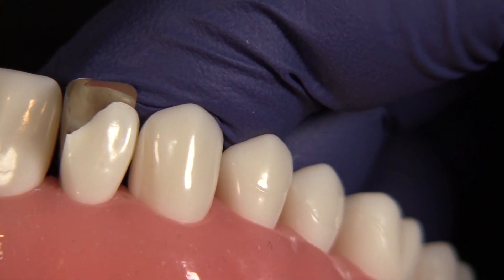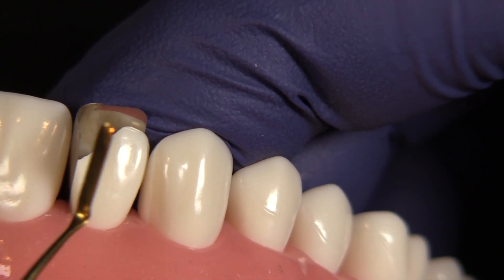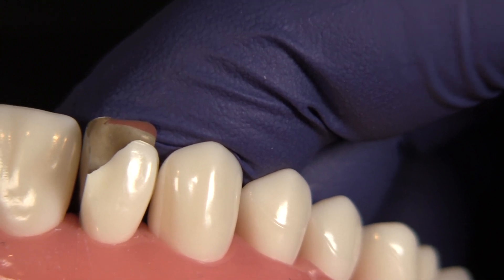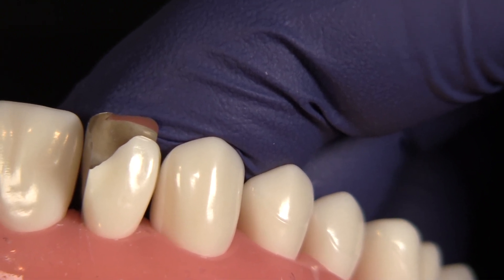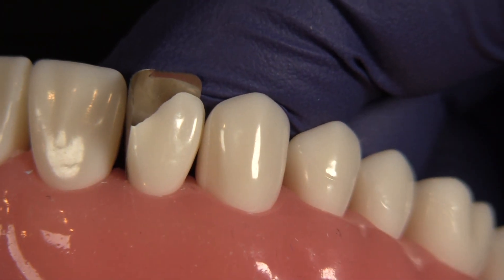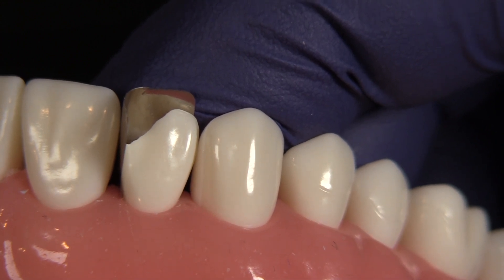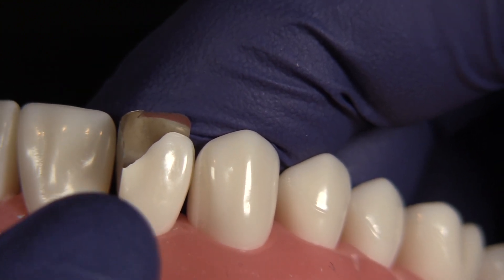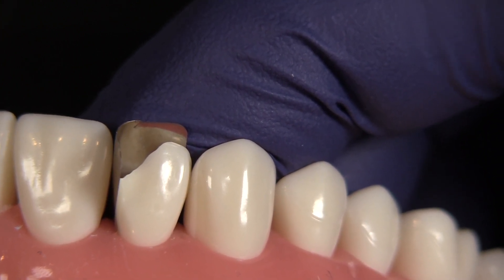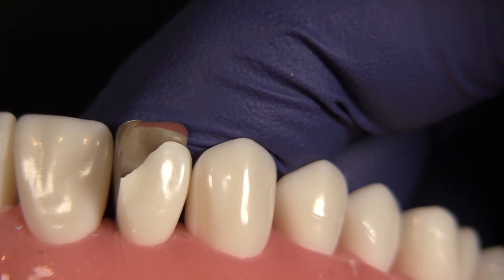This area here is the aesthetic key, and I want control over that — I want my composite to blend into that. But this area here, that's going to be taken care of with this system. And that's what I love about this system. There are a lot of other systems you can use to restore a tooth like this; it's a difficult tooth to restore. But with this, I don't have problems with that interproximal anatomy, and I can get a more predictable marginal seal because I don't have to worry about that band deflecting away from the tooth.